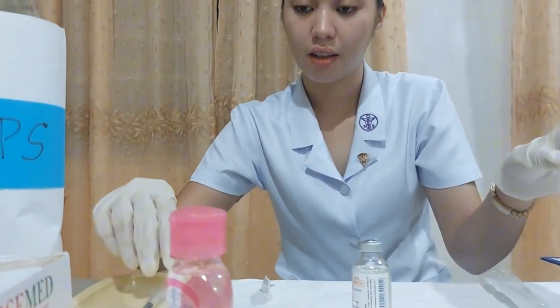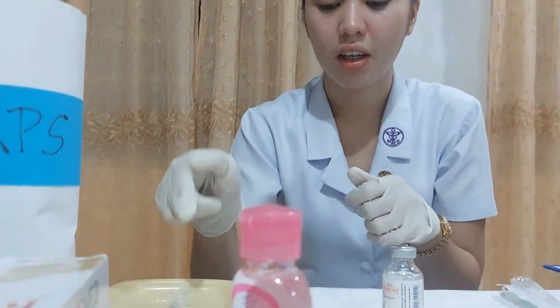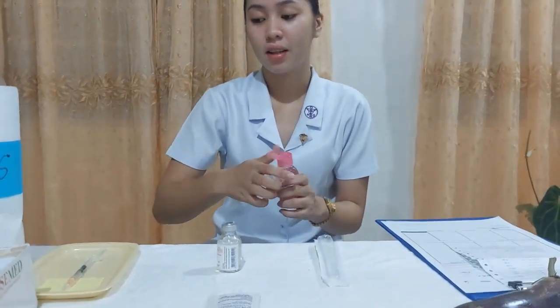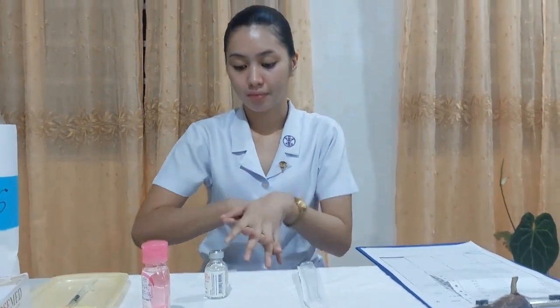Okay, and now with the medication sticker. I'm just going to discard what needs to be discarded, and also discard the used gloves. And for hand hygiene, now that we have prepared the medication, we're good to go to administer it to my patient. Okay, so let's go.